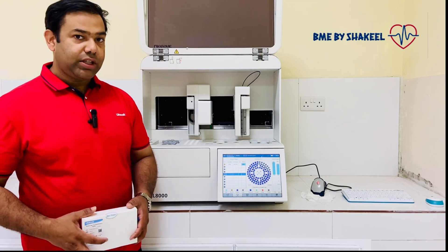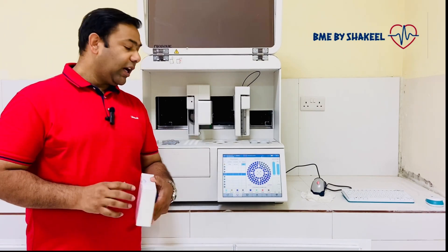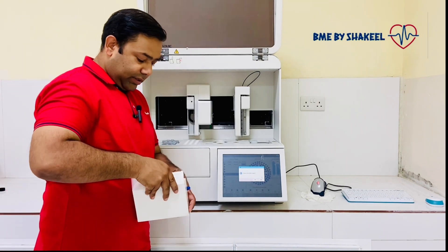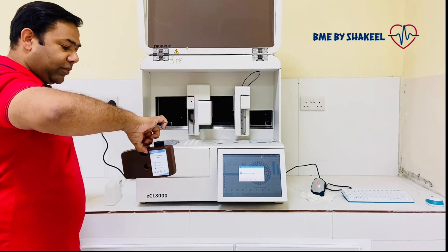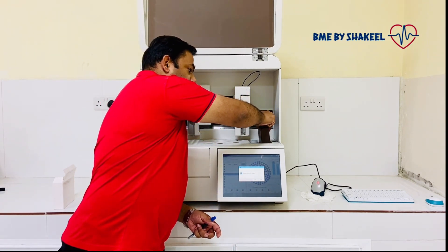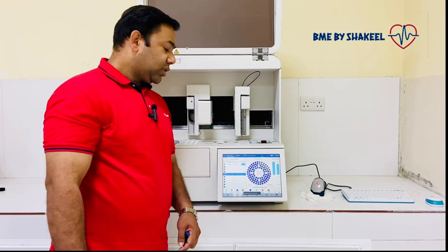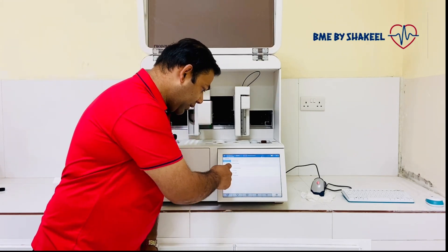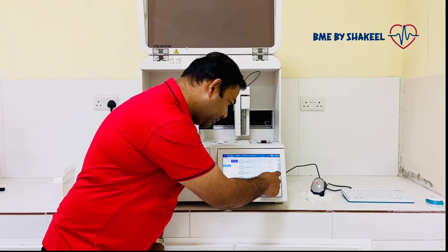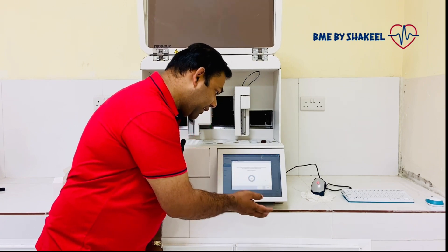Whenever you restart the machine, it will ask you to do the measuring self-maintenance. For this, we have a dedicated measuring self-maintenance buffer. Remove the regular buffer from the analyzer and replace it with the measuring self-maintenance buffer. Open the cover and insert it. Then in the software: click Application, then Maintenance, then Maintain Instructions, then Measuring Self-Maintenance, and click Start. It will take approximately 13 minutes.